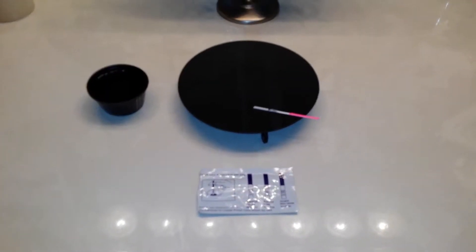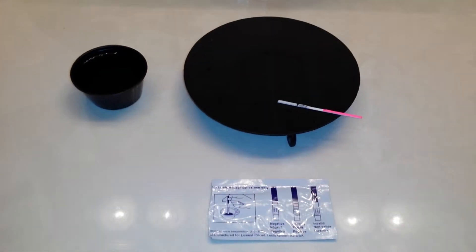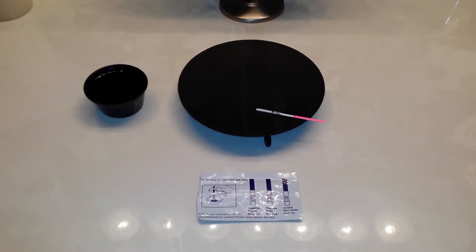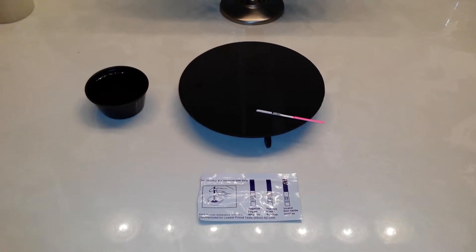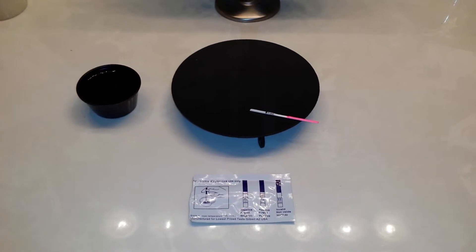Hi everyone, happy Friday. I just wanted to make a short little video to test and see if my OPK would come out positive. If it does, there's going to be a part two to this video because I have another experiment with this OPK.